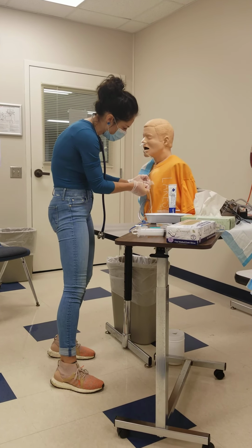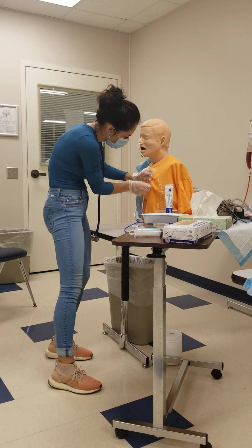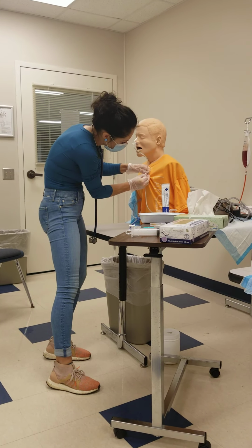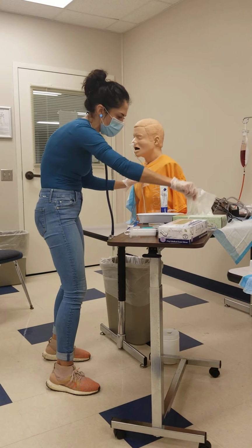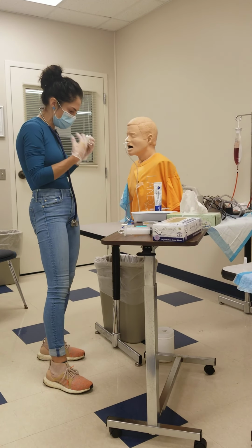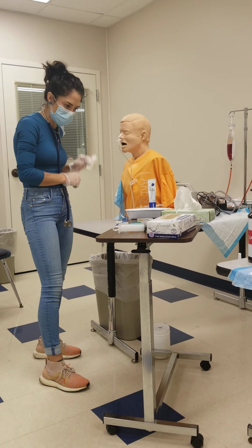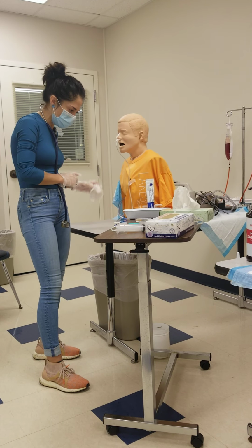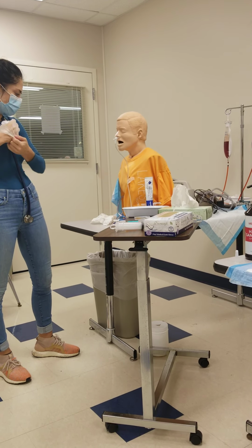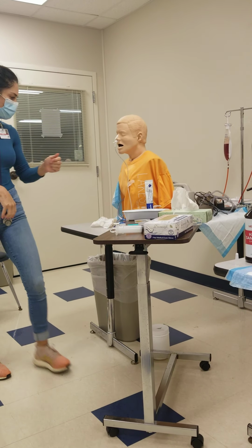Okay, and then I make a little flag, and I put my pin through that flag of tape. And we've got that. And the patient also would have had a tissue, should he have any spit or anything that he needs to blot his face with, he'll be good for that. We will, like I said, send him down, or have X-ray come to the room, to confirm the placement. I'm going to wash my hands.